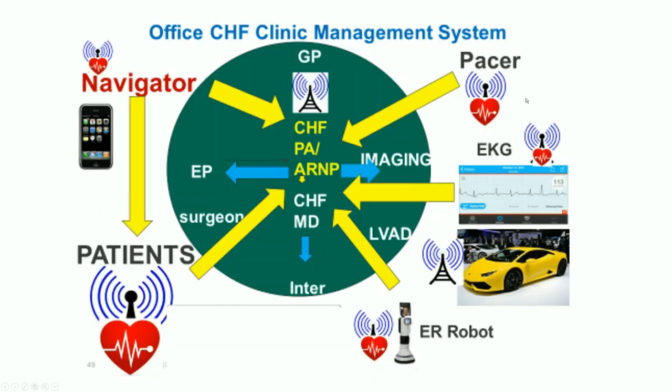And so that's very easy to stay connected. And then we have pacer connections now, where the patient has a home pacer unit right by their bedside, and they connect it up, and it goes by phone to email, and my PA can get online and take a look and see what's coming in today. And then we can talk from the car while you're driving. You know, hopefully you've got Bluetooth, and so you can be in touch at any time.